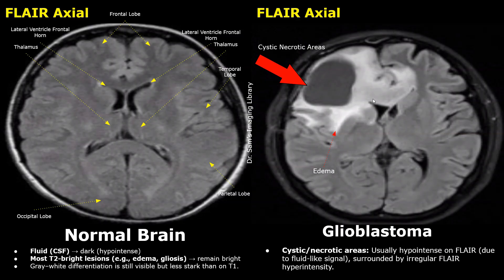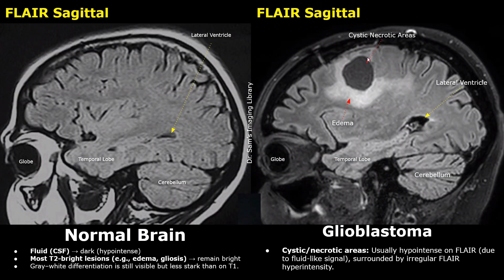Comparing this with other images, especially the T1 contrast image, which will show peripheral enhancement and a central hypo-intense core — this indicates a glioblastoma. This is the same case in the sagittal plane. The mass is predominantly cystic and is surrounded by hyper-intense edema.